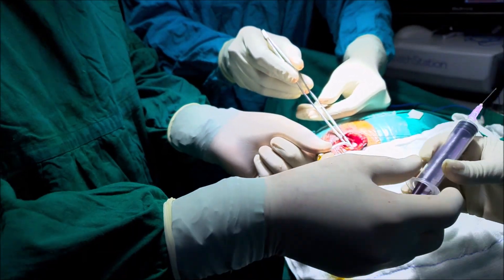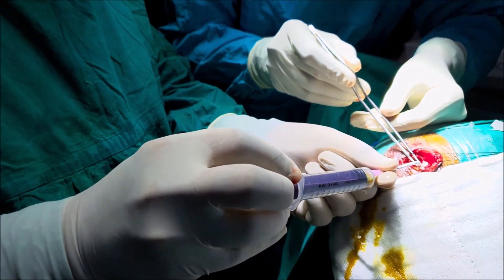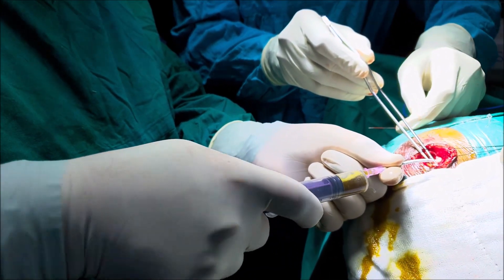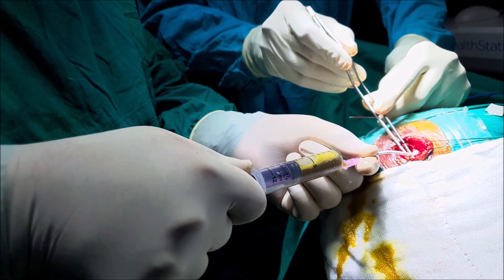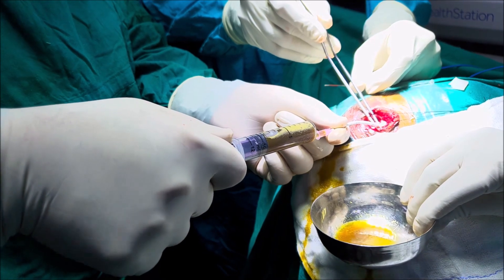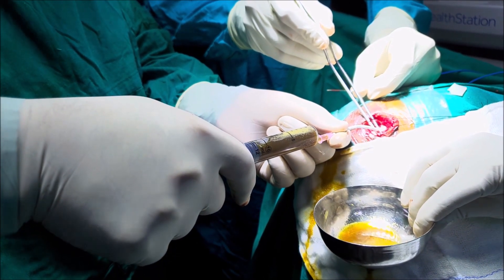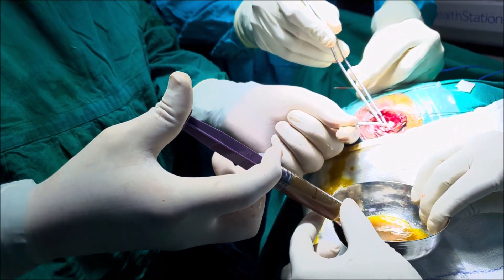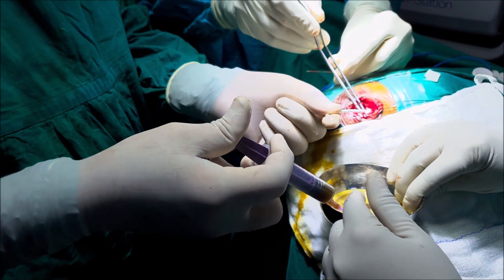The aspiration procedure is very slow and gentle. As we keep aspirating, the cyst keeps reducing in size and collapsing. We have obtained more than about 25 ml of fluid from the cyst — a thick yellowish-greenish fluid. In the literature it is described as motor oil colored fluid. We obtained almost 25 to 30 ml of cyst fluid in total.